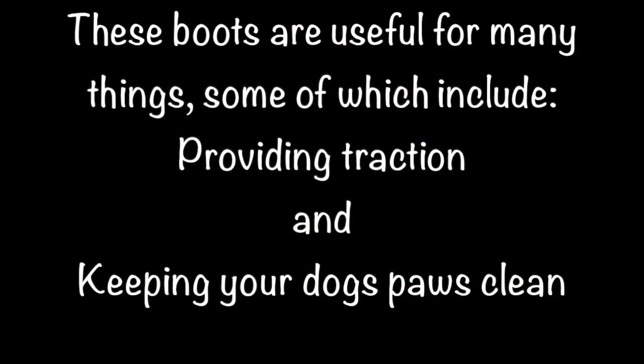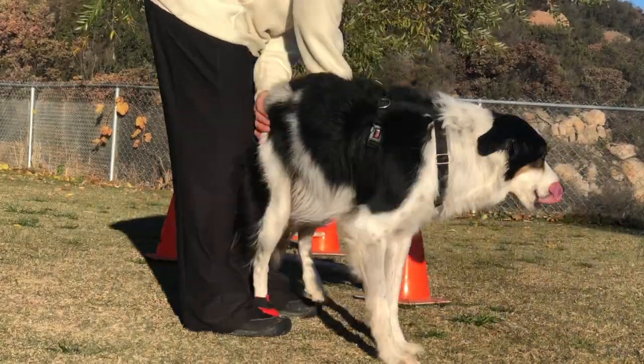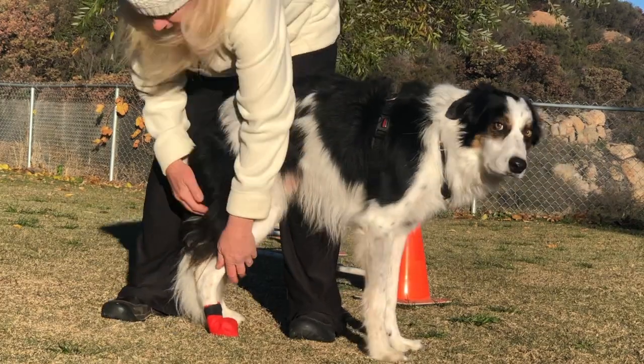These boots are useful for many things, some of which include providing traction and keeping your dog's paws clean. The bubble paw boots are also very easy to put on and take off.